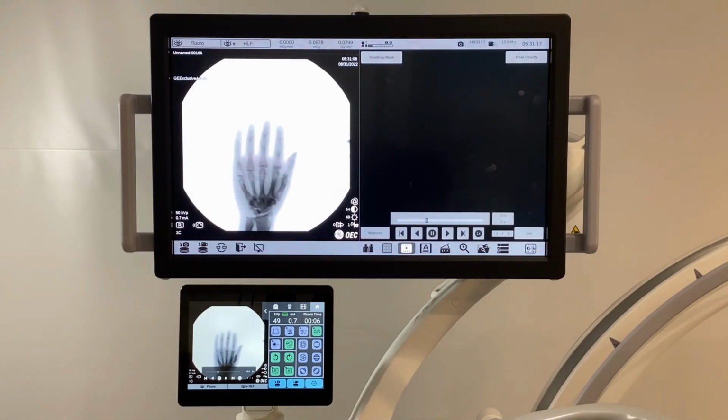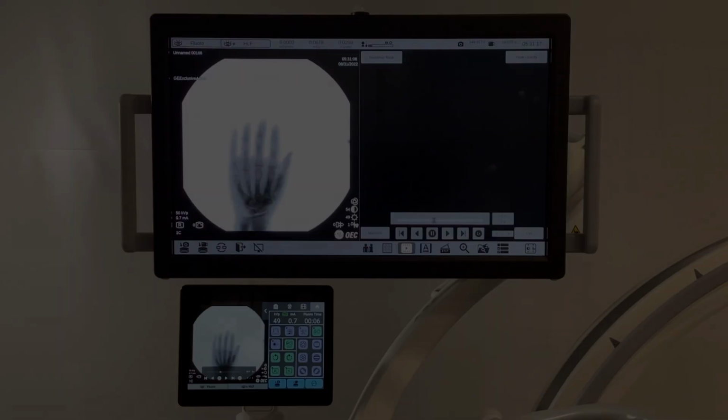Depending on your system defaults, it may immediately play back. Otherwise, visit your image directory. Fluorostore availability will depend on software configuration.